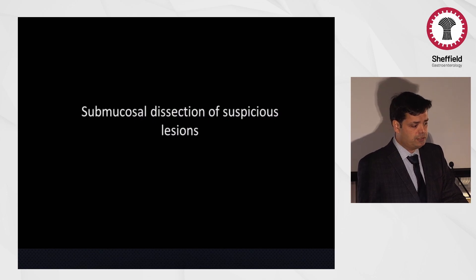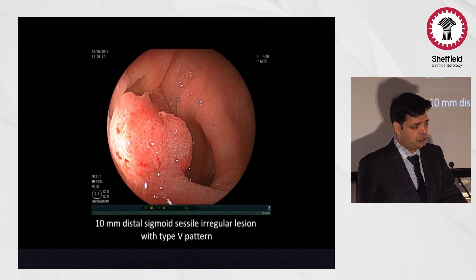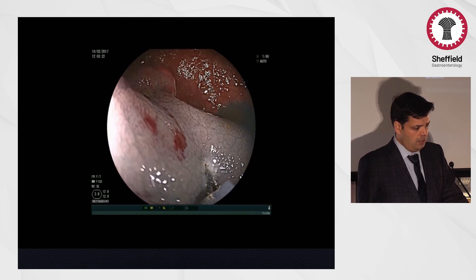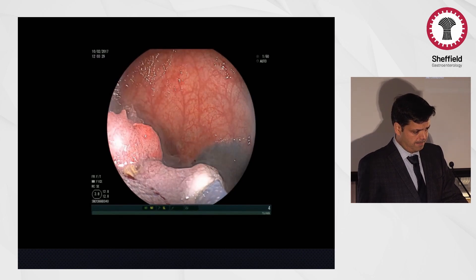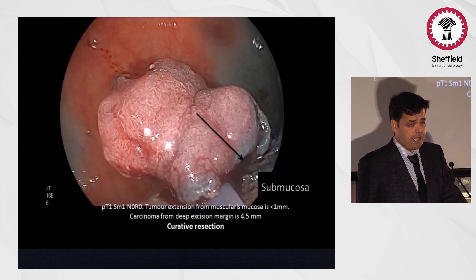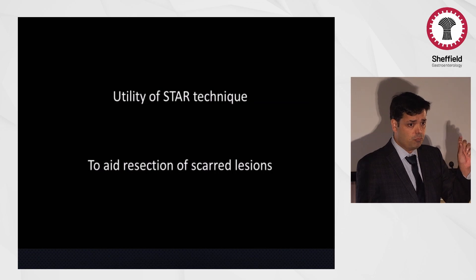So where is this technique useful? If you're looking at a suspicious lesion less than two centimeters — like this smaller polyp, but you can see it's got nodes, which means it's very likely to be an early cancer — and it lifts well. Making a groove and extending it circumferentially. This was an SM1 lesion with an R0 resection. There was a good margin between the cancer of about 4.5 millimeters, and less than one millimeter of submucosal involvement — so this was a curative resection.